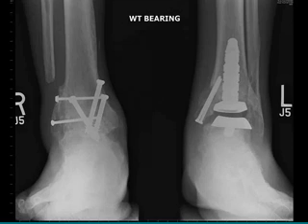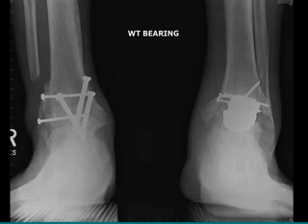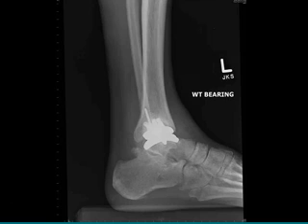Okay, so this is a 67-year-old male with an ankle fusion on the right. He didn't like it. He decided to get the new Eclipse ankle. This was an ankle designed to go in from the medial or lateral side. And you can see that he's got collapse of the medial malleolar side and screws going through that side. And so that didn't work, and the prosthesis was taken off the market.